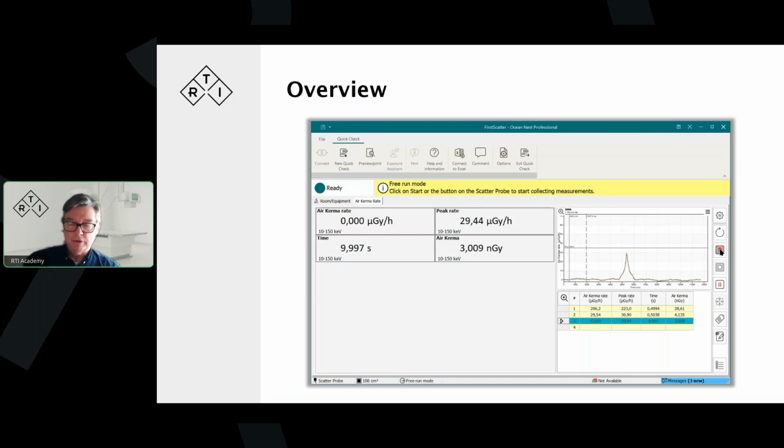And you saw from before, on the rear, you have the thumb button on the rear to start the measurement. That means that you can then start the measurement, make your exposure, and then stop and capture. And this is what's been done here. And then we can see that, yep, it's starting here, it's detecting nothing. And here, all of a sudden, we've got a measurement that starts and detects a measurement.